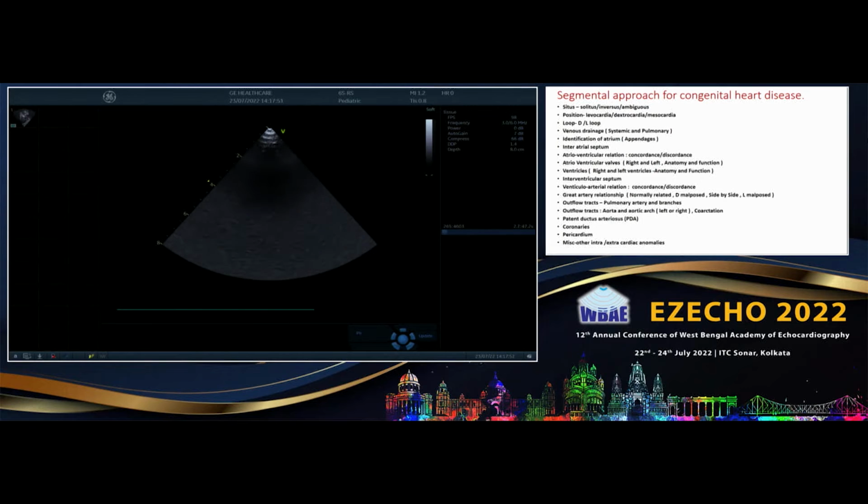Yes, that is another issue with the pediatric population: sedation, cooperation, and that we face. So this is a real-time demonstration, sir. This is the day-to-day problem that all congenital echocardiographers are facing. So a lot of sedation, chocolate, and whatsoever we can offer to them.